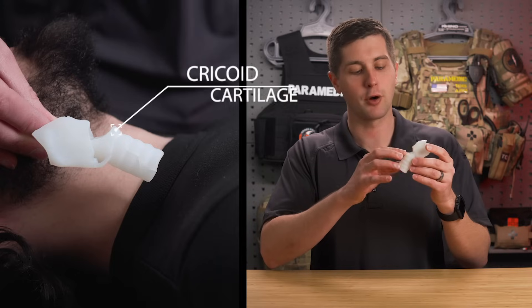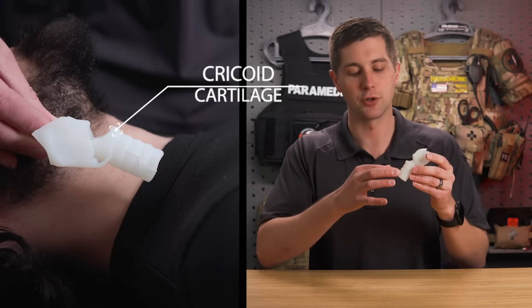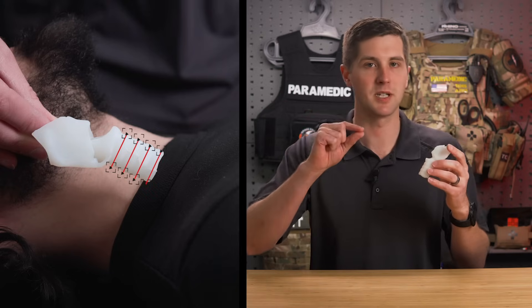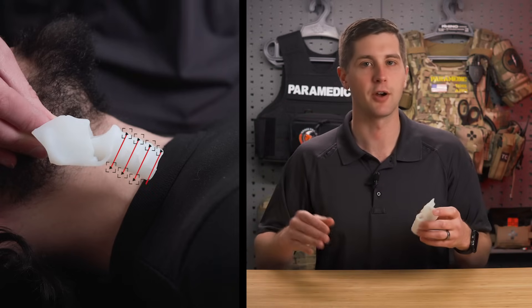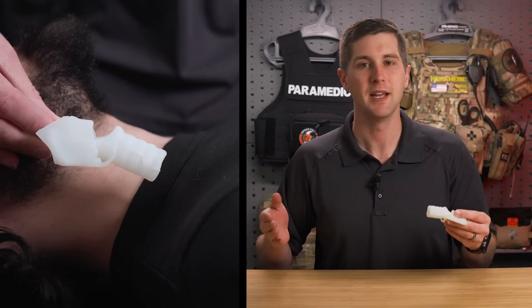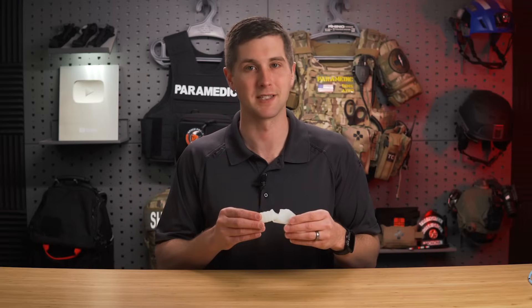Below that you have the cricoid cartilage and then you have your tracheal rings. These rings are going to be hard cartilage and then there is some tissue in between them, but it is very hard to insert the tube and can cause more trauma than necessary if that's where you end up accidentally cutting.